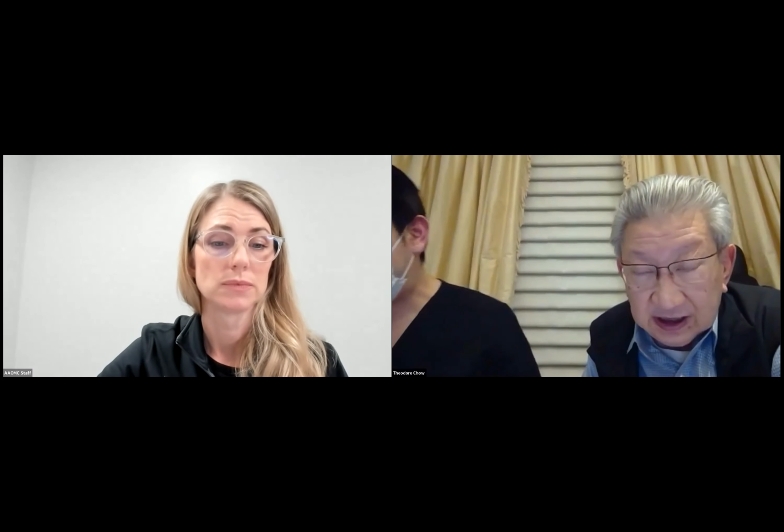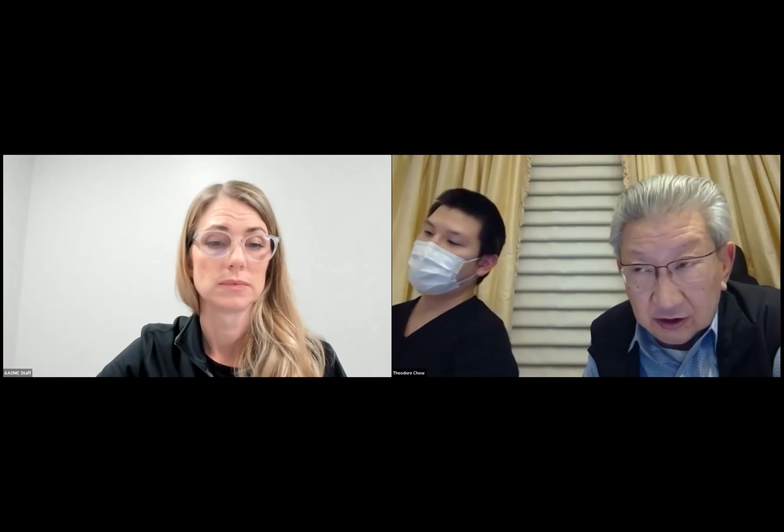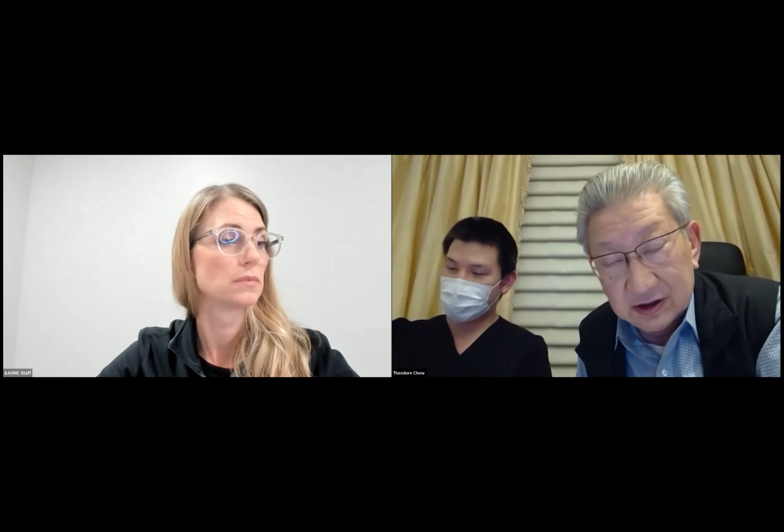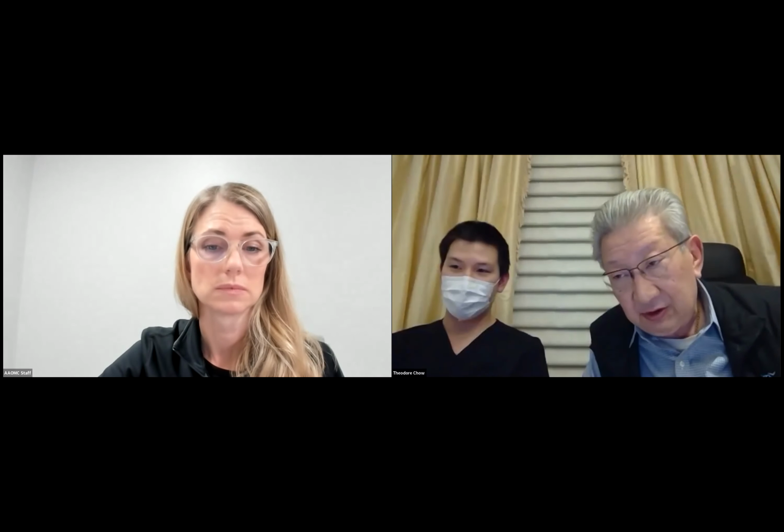Yeah, so I start from 5 micron with low refractive error, and then keep increasing with the larger targeting. So if you target at -8 altogether with Jessen factor, then use 8 micron. And if you have anything higher than -8, -10, then you use 10 micron. Anything more than 10 diopter, still 10 micron, because the high prescription creates a lot of flattening of the central cornea. So they give you a certain amount of tear film already there, so you don't need to go 12 micron, 13 micron. I tried it out, it'd be too much.